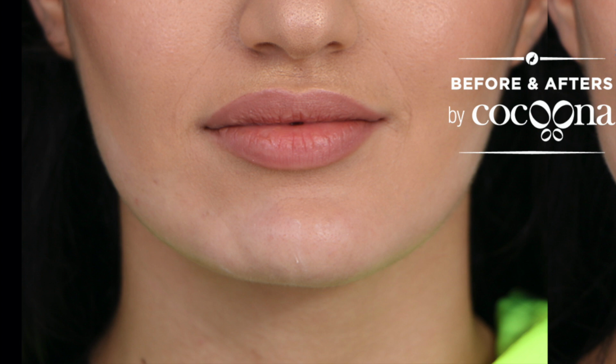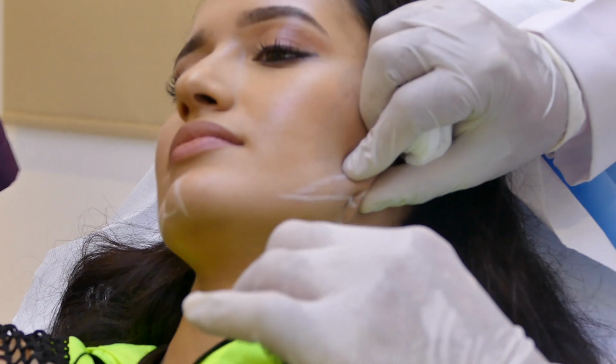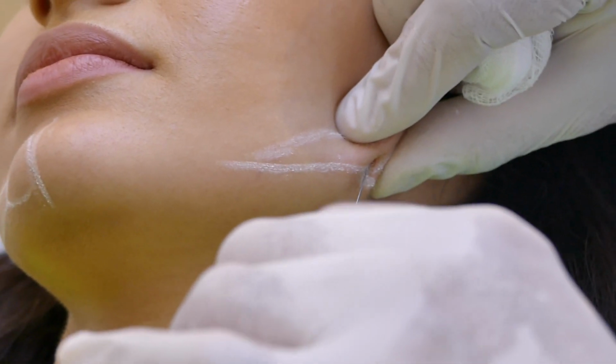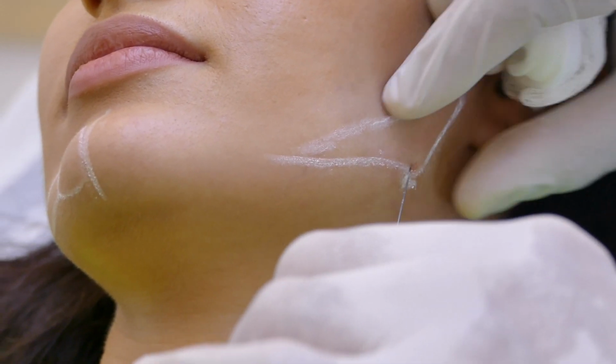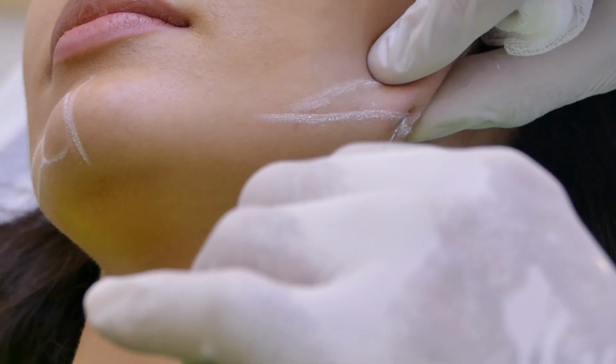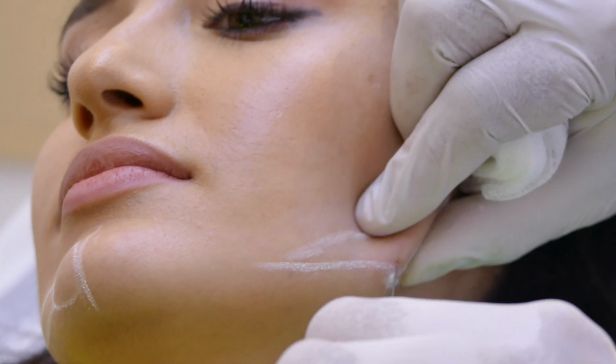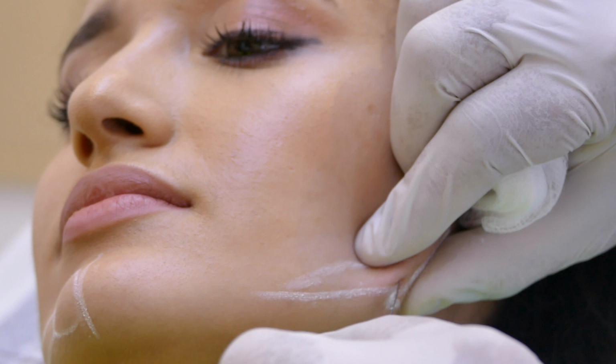Now this patient has a pretty good jawline, but she still wants to improve the jawline, and if you carefully look, she has very short vertical ramus of the mandible, and in the frontal view her chin height is short. So I have marked the vertical ramus and the body of the ramus of the mandible, and I am using a cannula to inject into the subcutaneous plane.